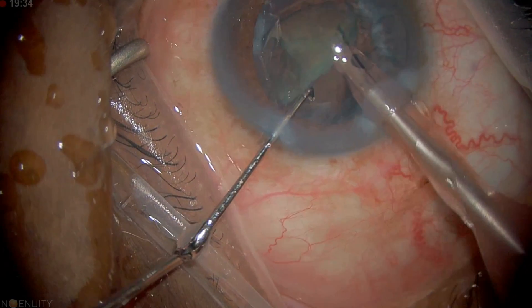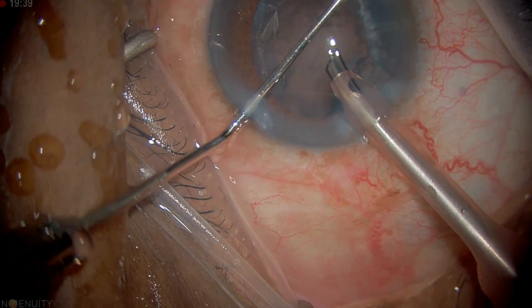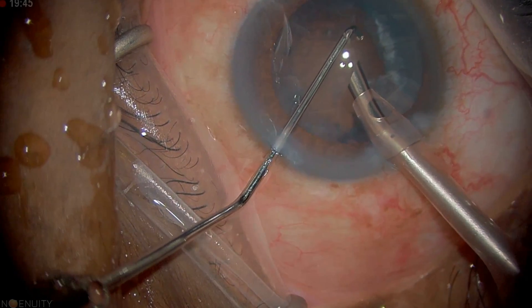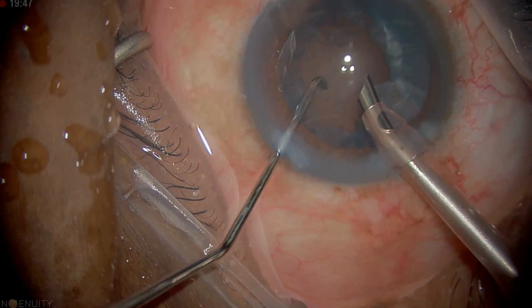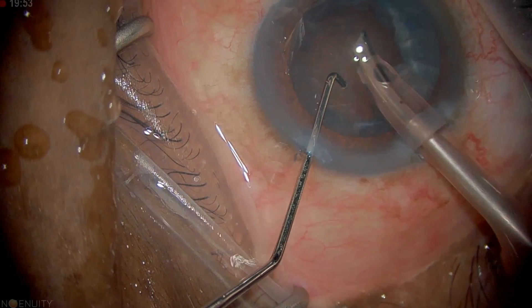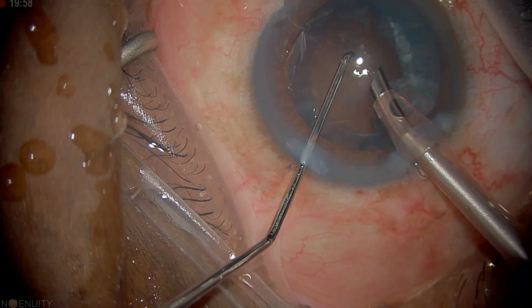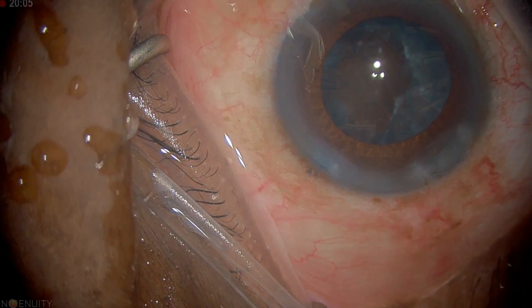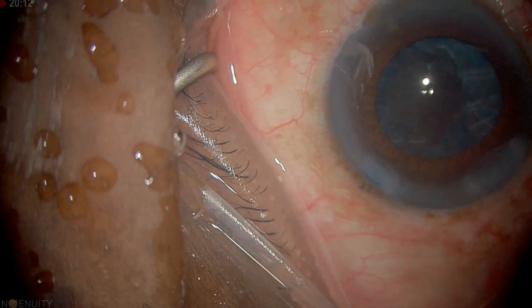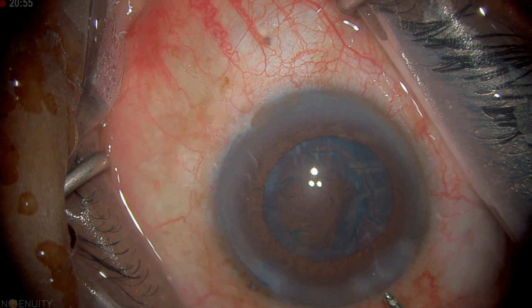I always tell my trainees: here is the midline and I don't want them eating pieces beyond the midline. I don't want them in the bag — I want them at the level of the capsular plane. You go into the bag, grab a piece, bring it up to about the midline above the capsular axis, and that's where we should be breaking up the nuclear fragments. Now we've got the nucleus disassembled and removed and we're going to go to cortical cleanup with the irrigation-aspiration.